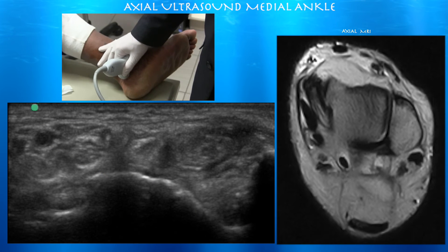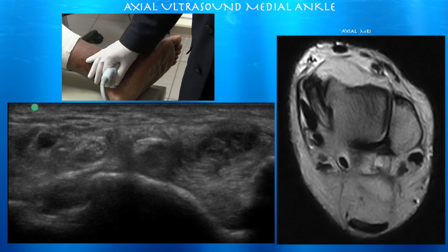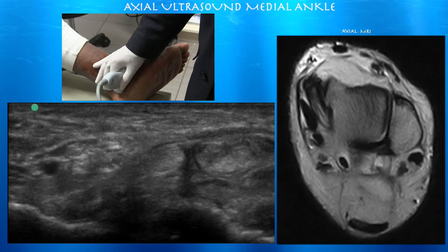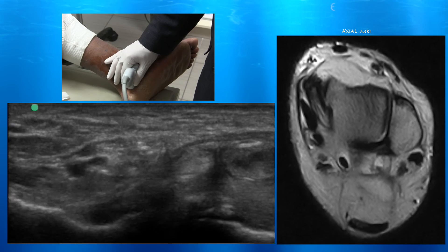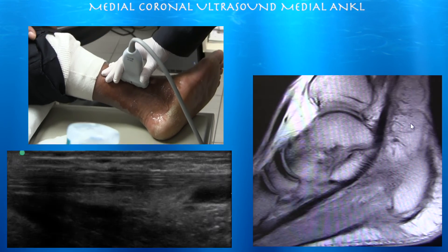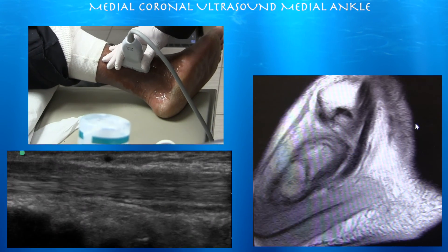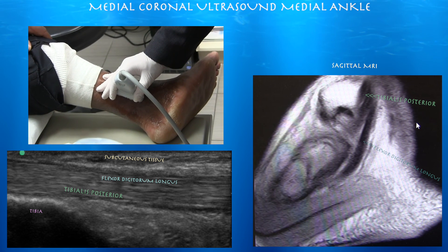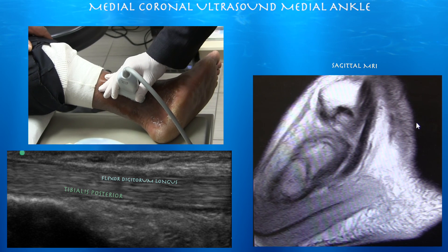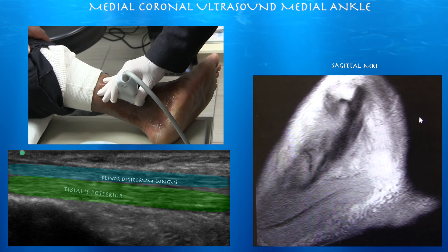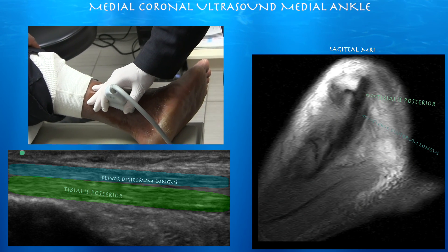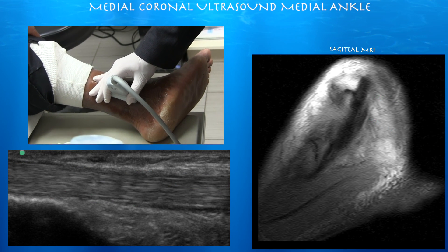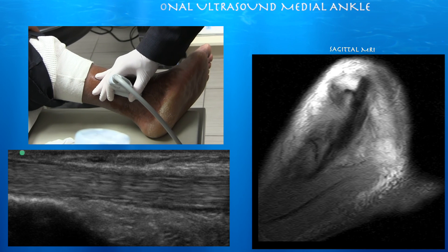Here's some anisotropy. Just toggling the probe and you can see some anisotropy of that tibialis posterior tendon. Starting at the tibia, the first tendon we're going to hit is the tibialis posterior. In sagittal views, sometimes it's hard to distinguish between tendons as they kind of roll into each other. I believe we just have two tendons kind of combined — tibialis posterior with the flexor digitorum longus — and you can see somewhat of a division between them.